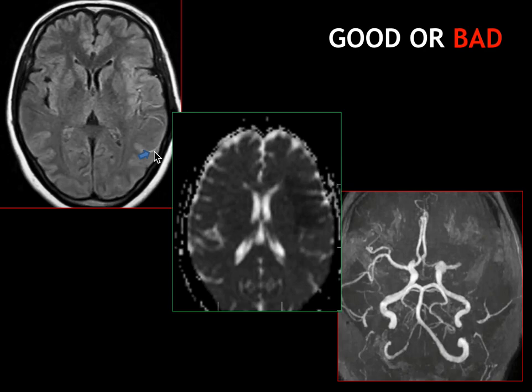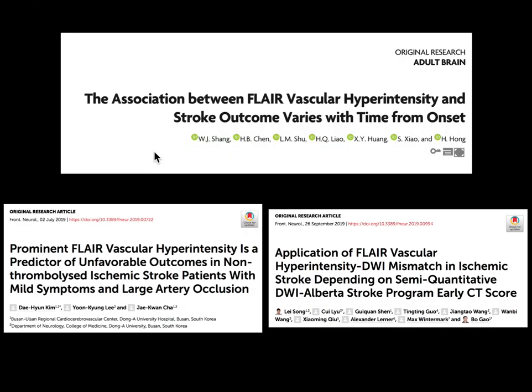Try to mention this in the report so that it indicates to the clinician that the patient might have a good outcome once reperfusion therapy is instituted. Kindly refer to these few articles which explain the concept, where various studies have been done using FLAIR vascular hyperintensities, giving an overall idea of FVH.